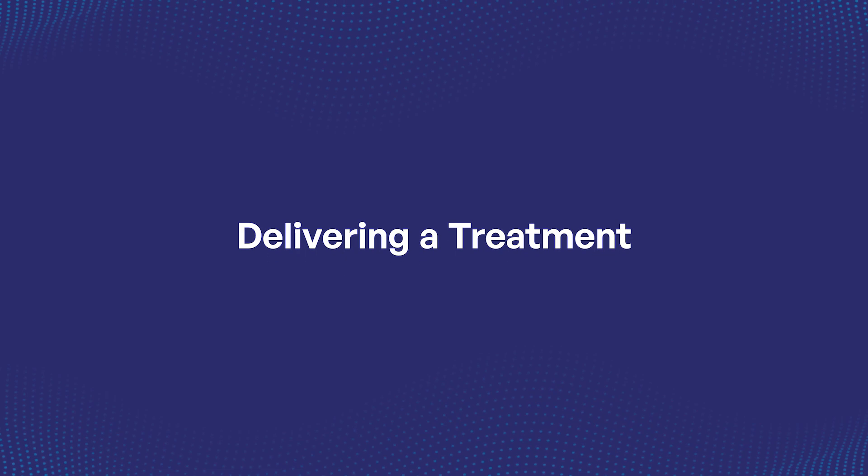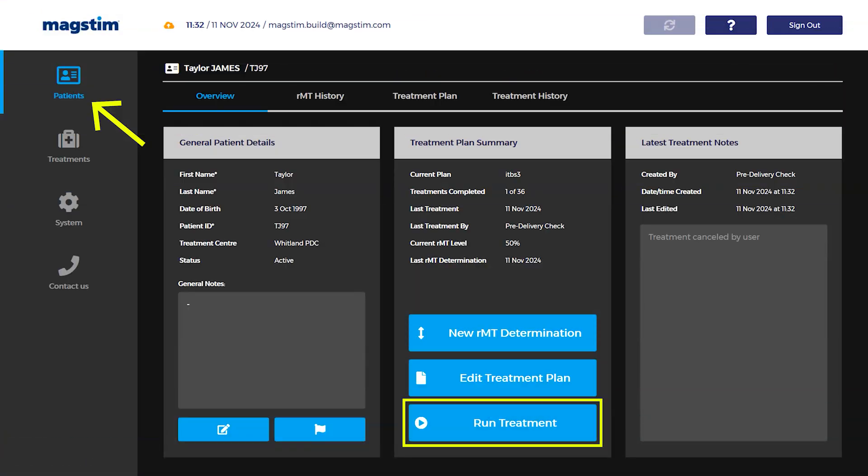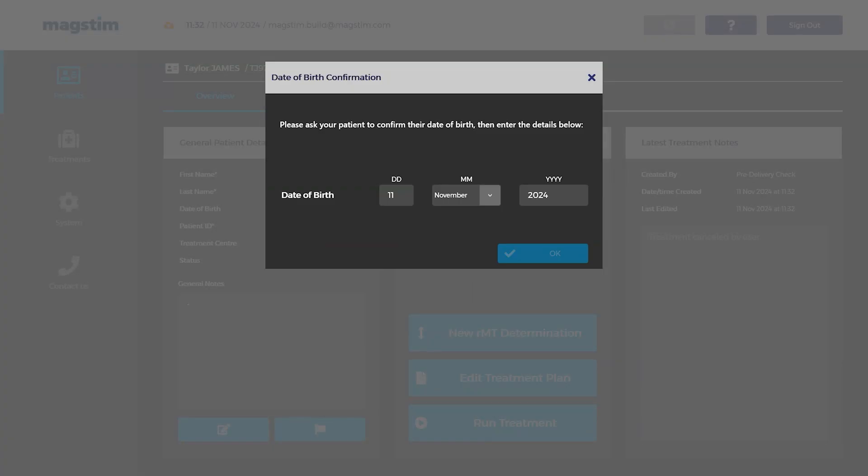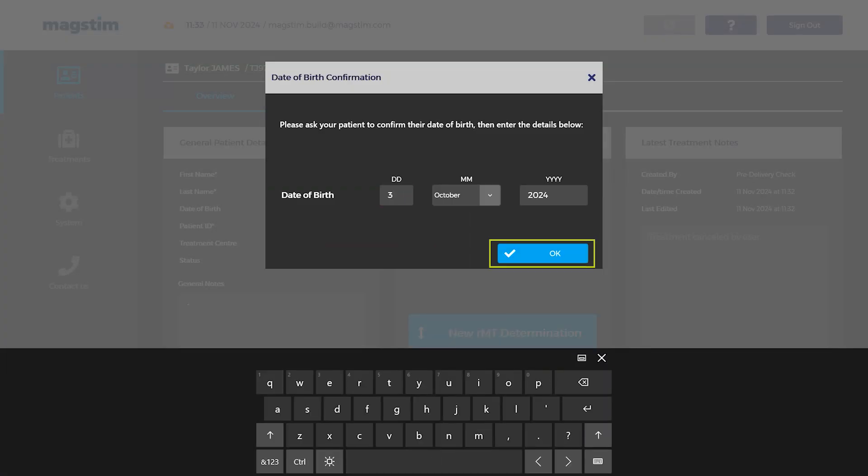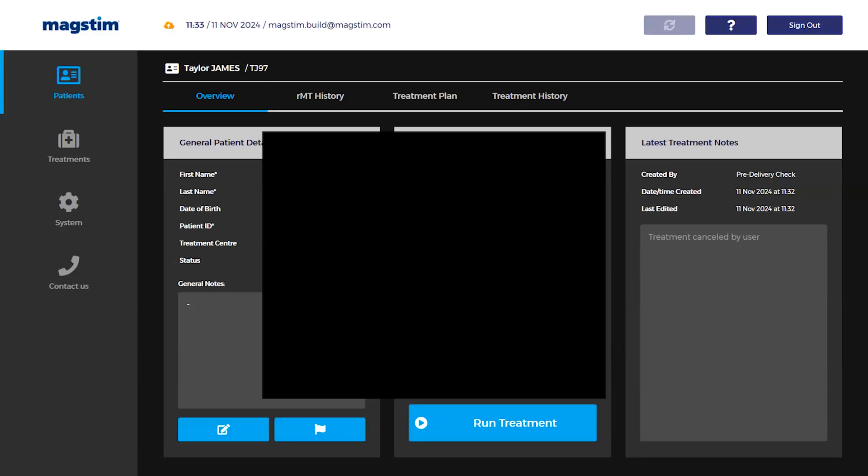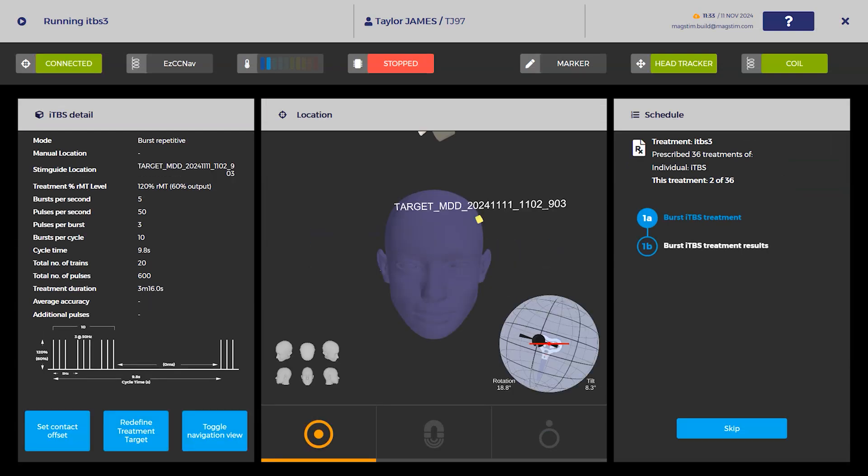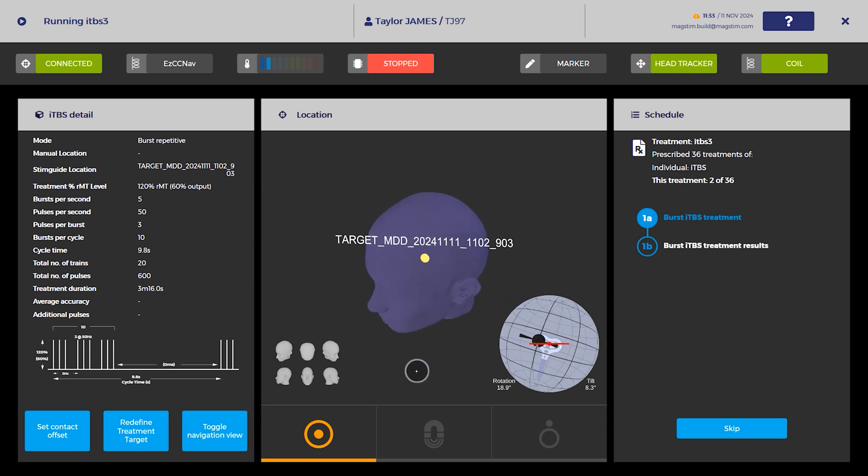Delivering a treatment: On the patient record, select Run Treatment. Confirm the patient's date of birth and select the check icon. Undertake the landmark registration process or select Use Existing Landmarks if the head reference tool hasn't been removed since undertaking the motor threshold assessment of the same session.